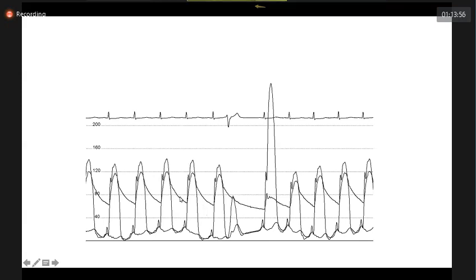So what is the spike and dome appearance? Because of rapid ejection in the early systole, the peripheral aortic pressure will show a spike appearance, followed by a dome because of dynamic obstruction. So your homework is completely about what will happen to the pulse pressure and what will happen to the aortic pressure. And what are the mechanisms of this Brockenbrough phenomenon? Yes, sir.